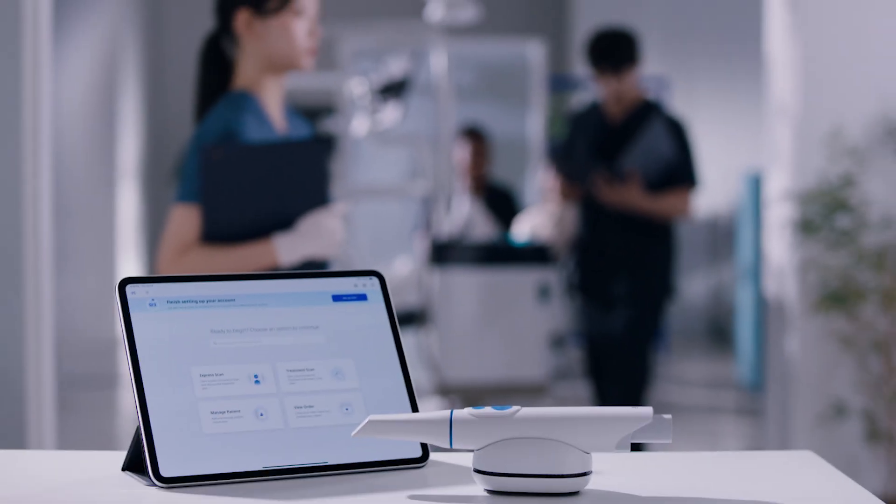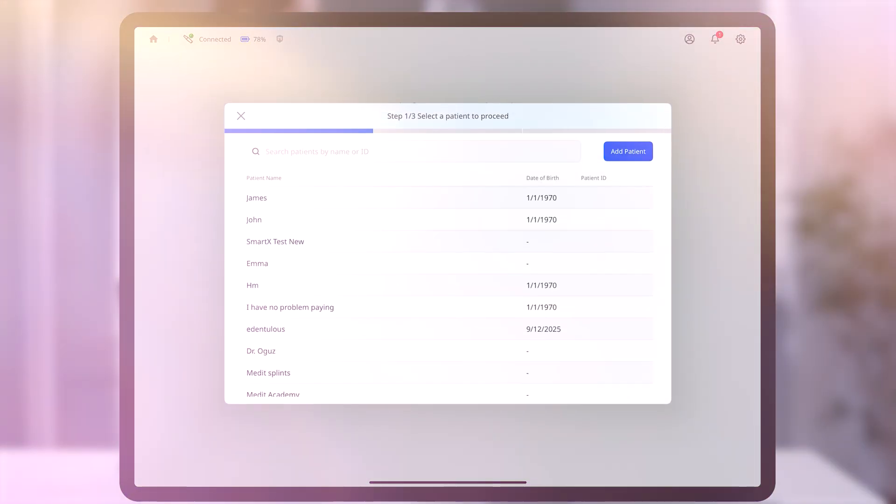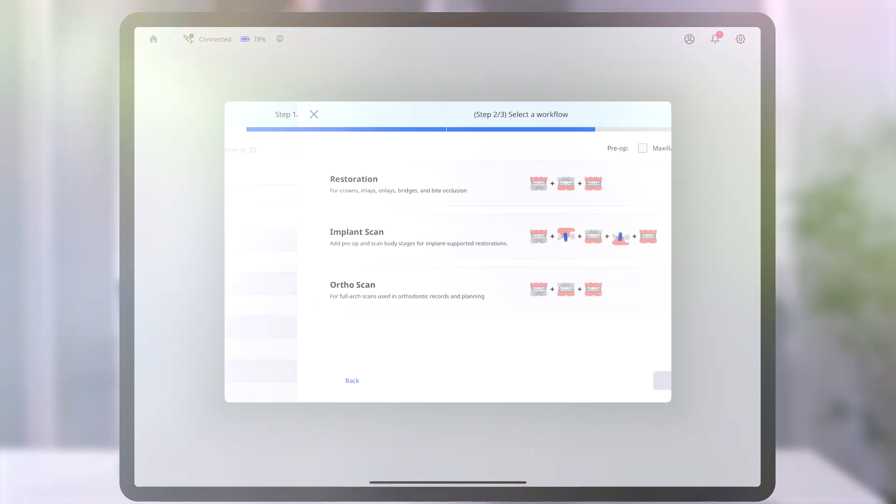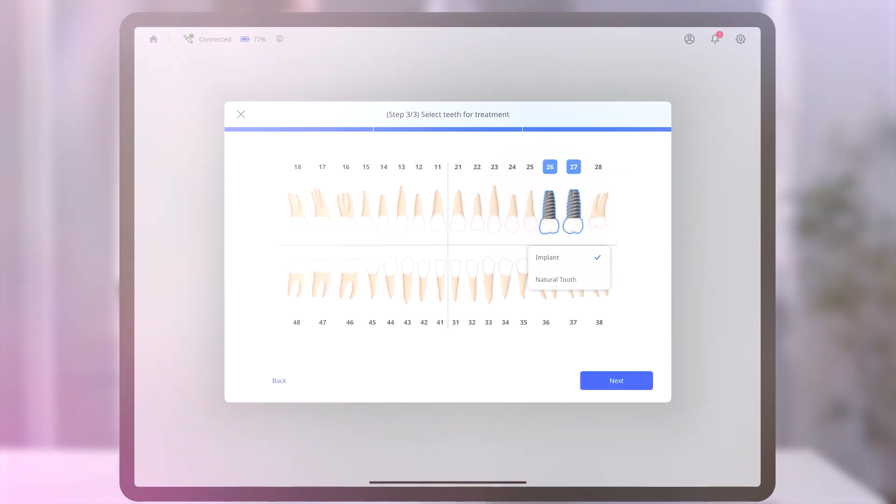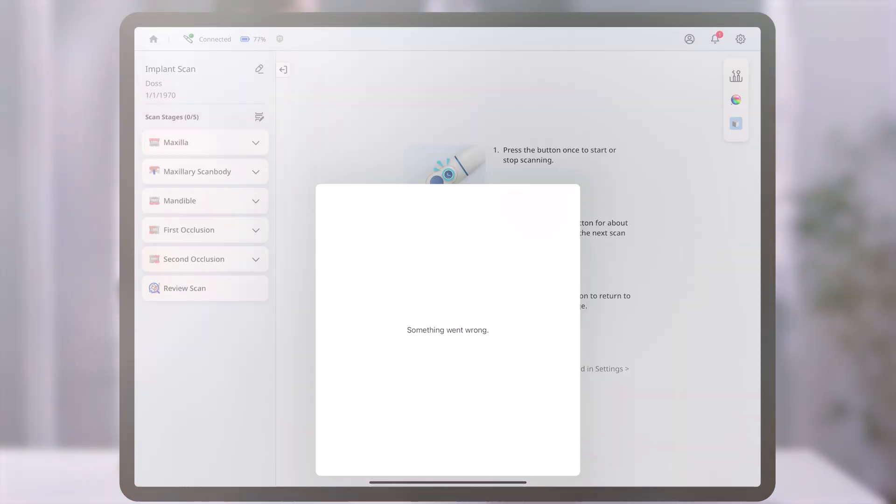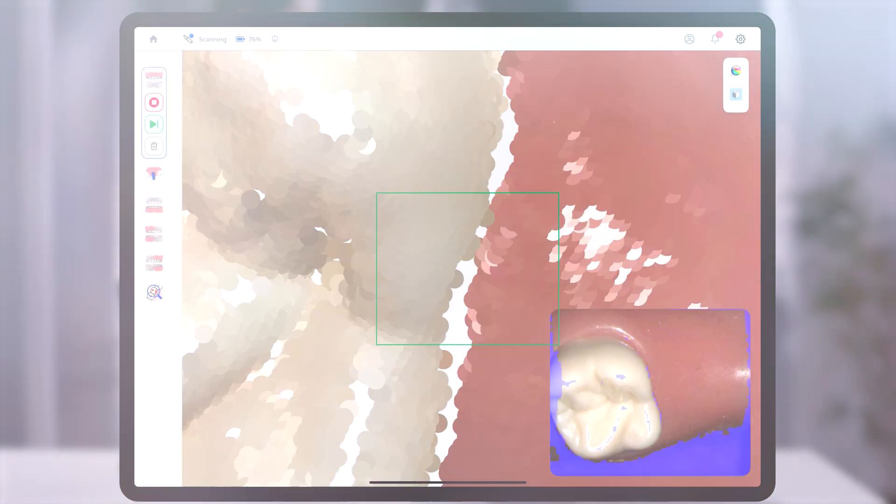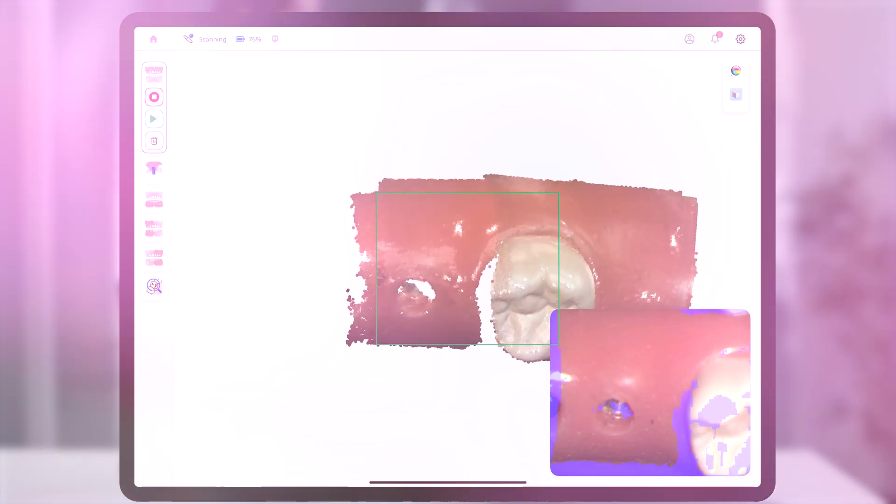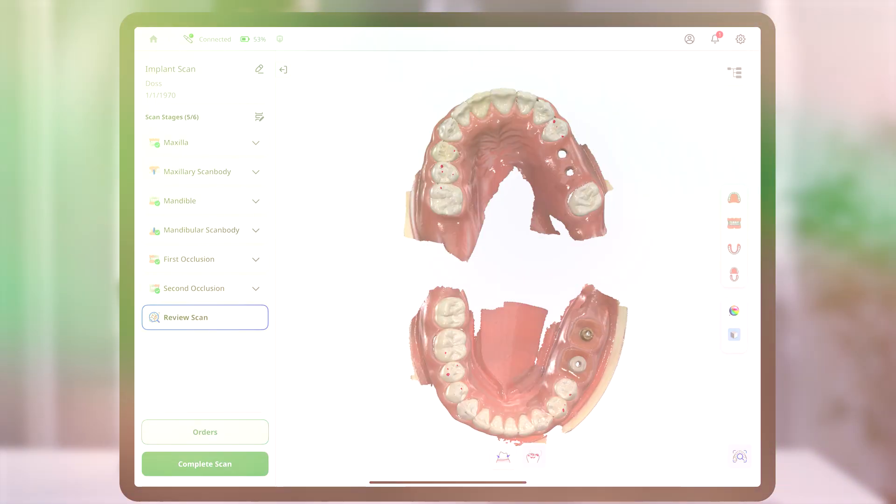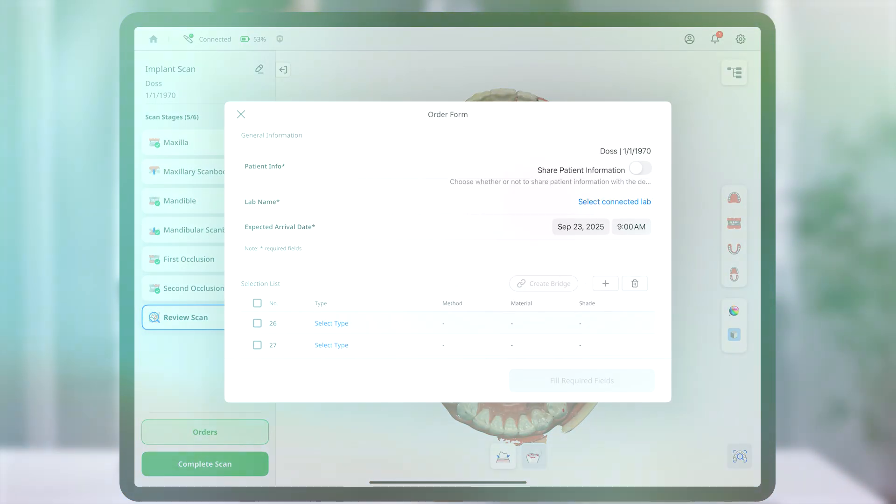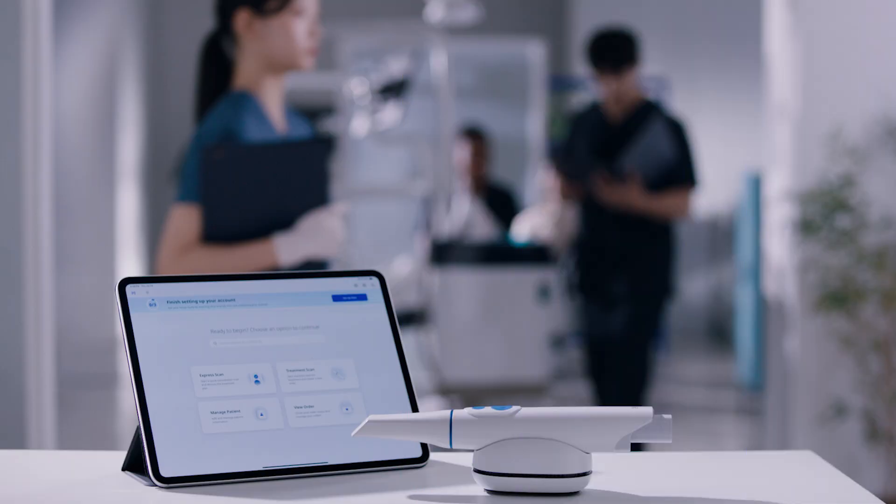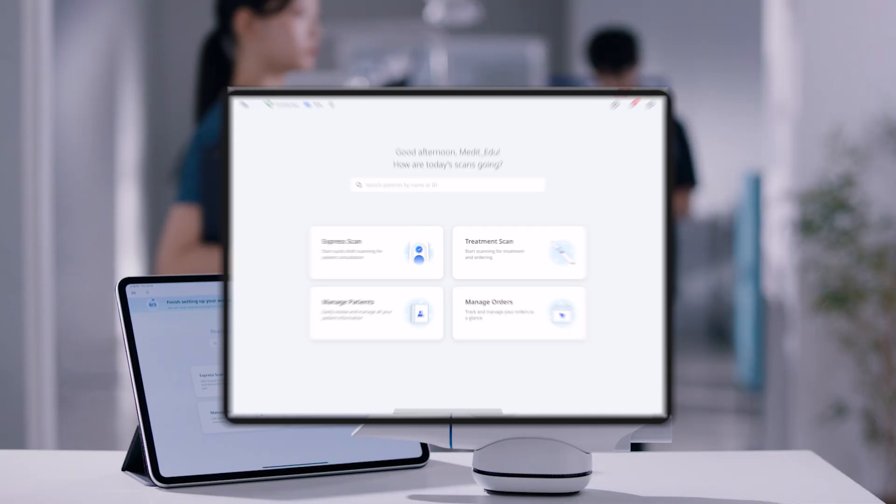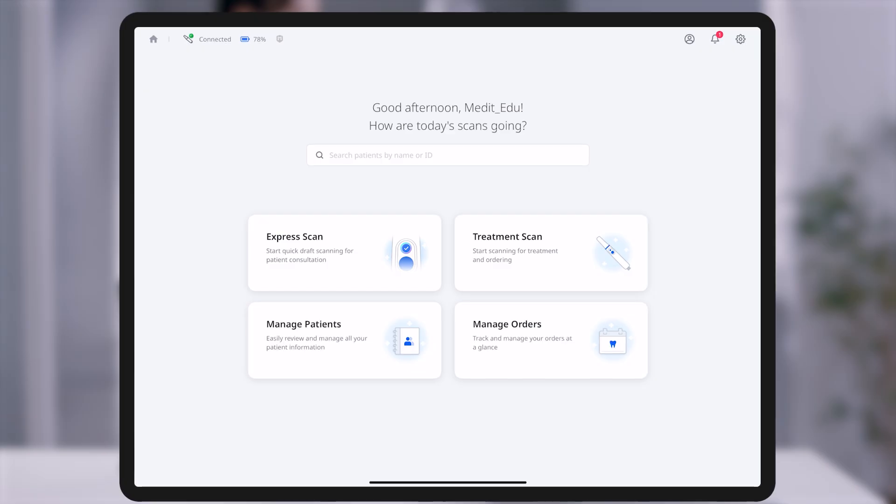If your clinical workflow requires detailed scans for prosthesis fabrication or treatment planning, choose the treatment scan mode. It offers a structured workflow from patient registration to purpose-specific scan options. Let's now take a closer look at the treatment scan mode.